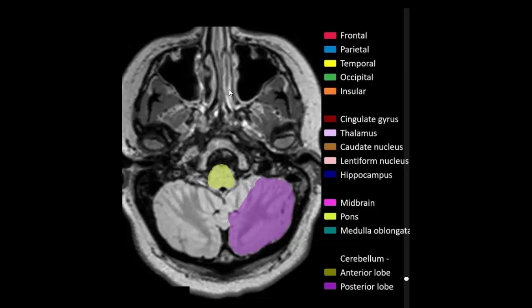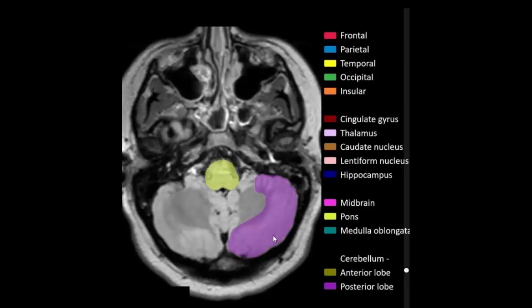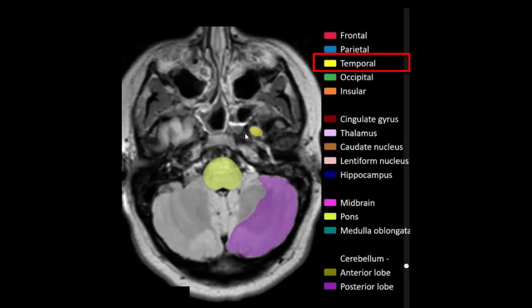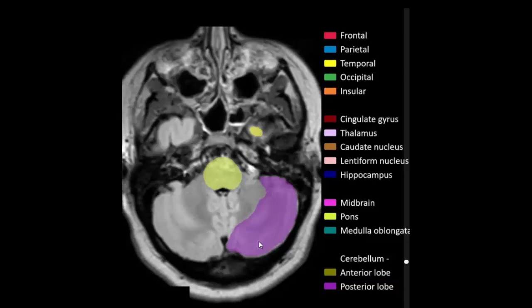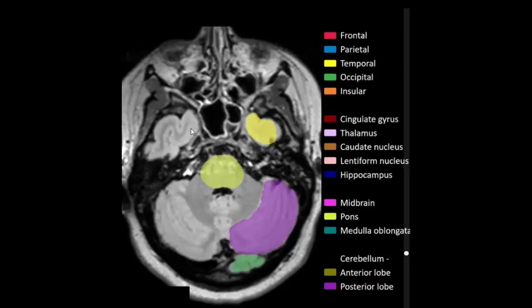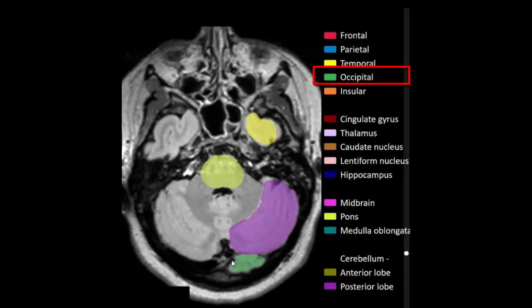Right and left temporalis muscle, right and left lateral pterygoid muscle. Right and left temporal lobe, right and left posterior lobe of cerebellum. Occipital lobe.